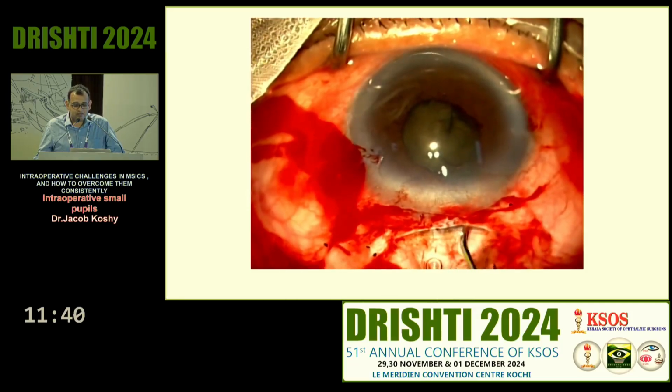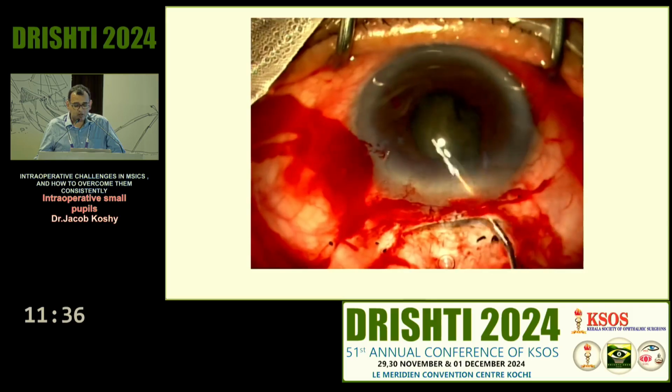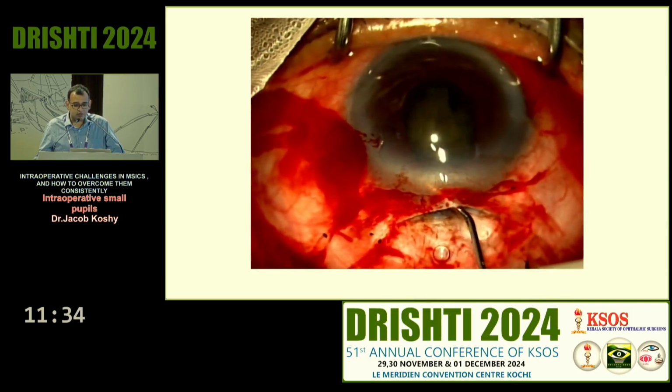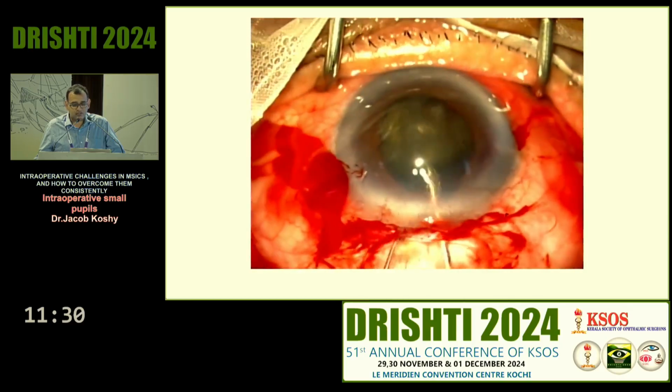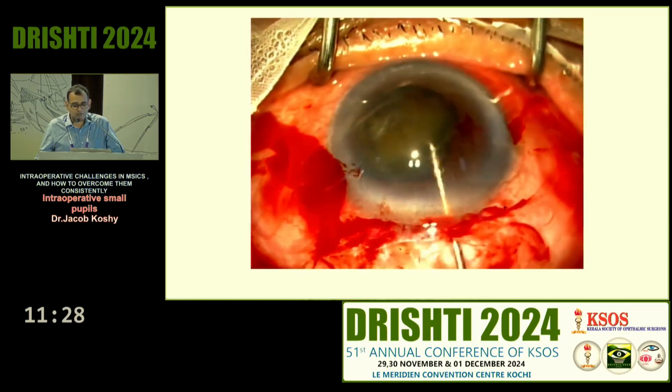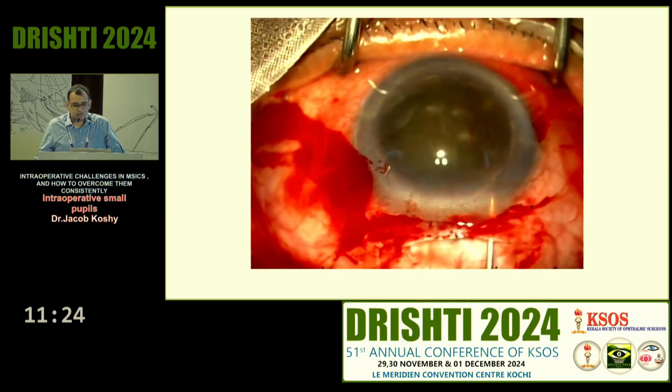Now I'm left with the difficult task of prolapsing the nucleus. Good hydrodissection is absolutely essential, and you can use the 2-hook technique, which is now very popular, to get 1 pole up and then rotate the nucleus into the anterior chamber. So till here it is fine.